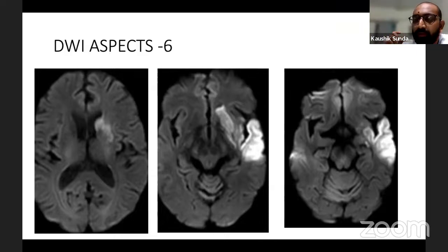The other reason why we need CT angio is, now that I know that the collaterals are good, that means it is telling me that I am dealing with a chronic lesion. If it is a chronic lesion, was it a stenotic segment that got occluded, or was it a chronic occlusion? How do we know that in CT angiogram? See, supposing you have a 95% stenosis, then also you will develop good collaterals, like leptomeningeal and all that. You will also develop good collaterals if you have a chronic total occlusion. Correct? What will tell you the difference? How will a CT angio differentiate these two?